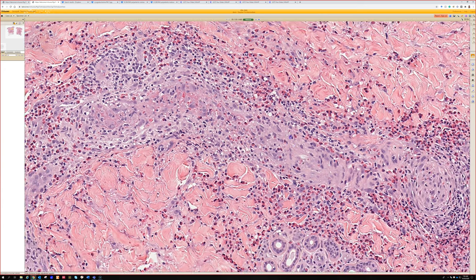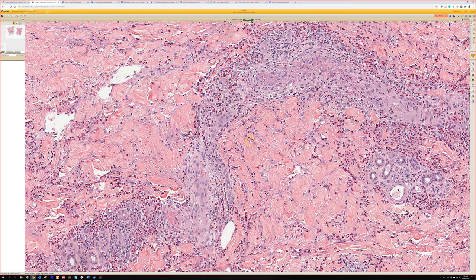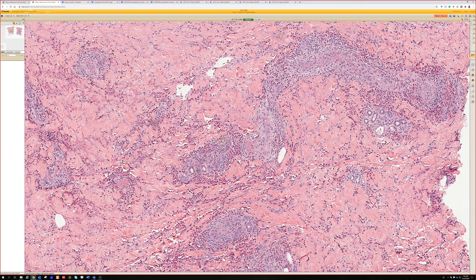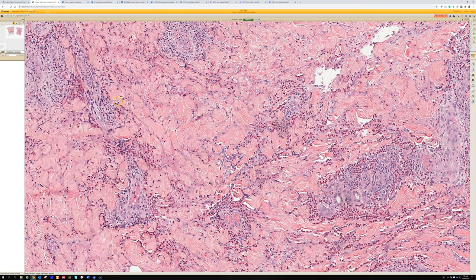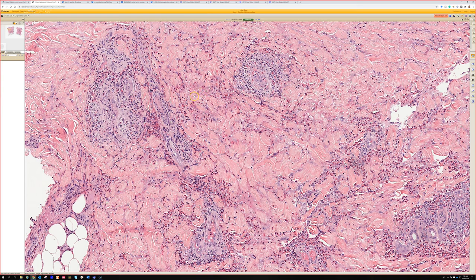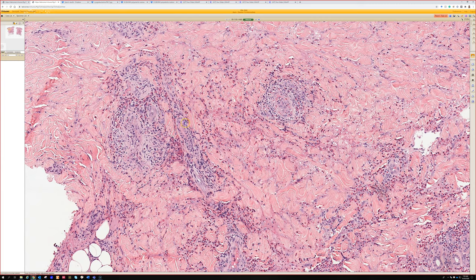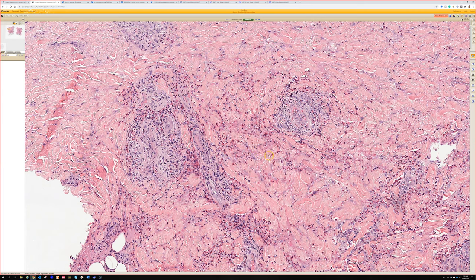So it's basically a variation of leukocytoclastic vasculitis in which there are a lot of eosinophils and it's superficial and deep. Right away, you want to think of Churg-Strauss disease, also known as eosinophilic granulomatosis with polyangiitis or eGPA. I have seen some cases that just look like regular LCV but with eos — this one's really florid in eos. Sometimes the eos can cause degeneration of the collagen and you can get things that look almost like palisading granulomas.